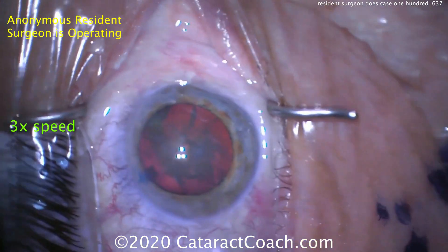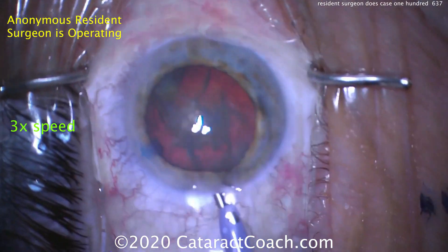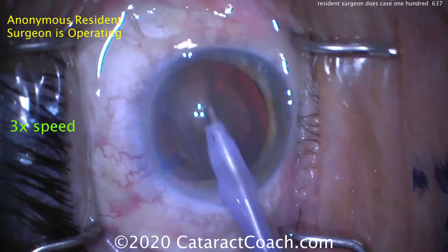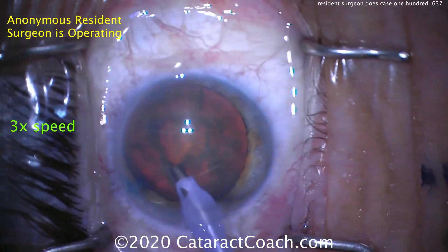Let's see the technique of nucleus division. Here comes the phaco tip with a purple sleeve — so a 2.8 millimeter, 2.75 millimeter incision. And cleaning up some of the anterior cortical material. So far so good.